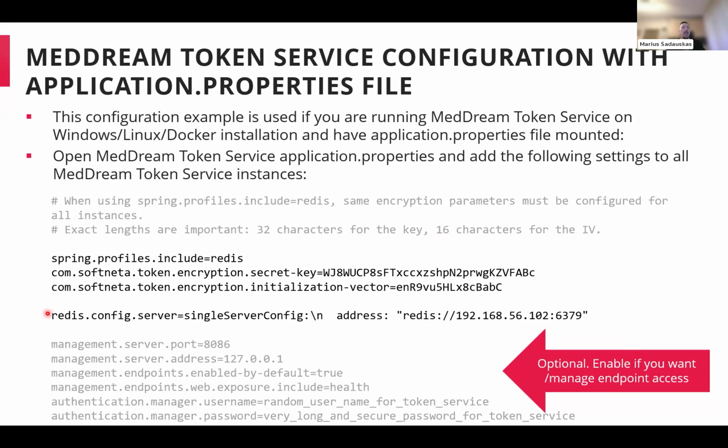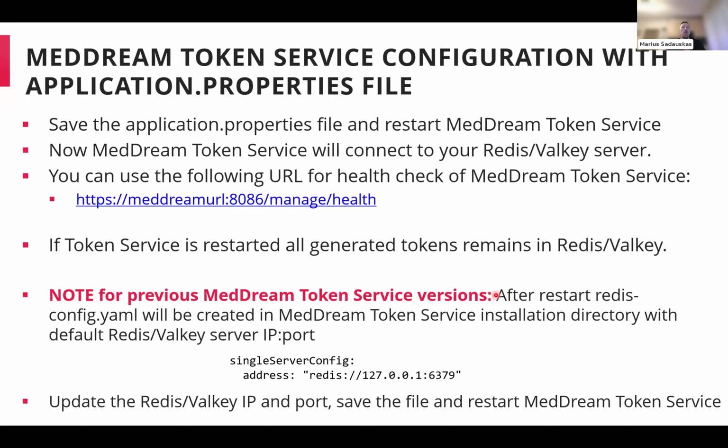And the Redis config parameter is the same as in MedDream. So once you add this, restart the MedDream token service, and it will connect to the Redis or Valkey server or service, and you will be good to go.